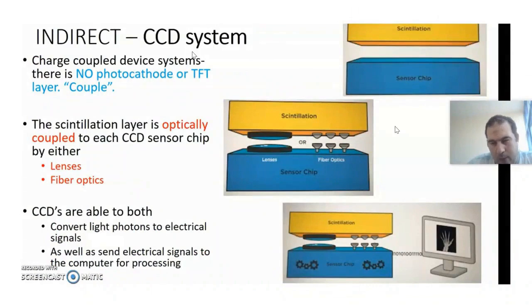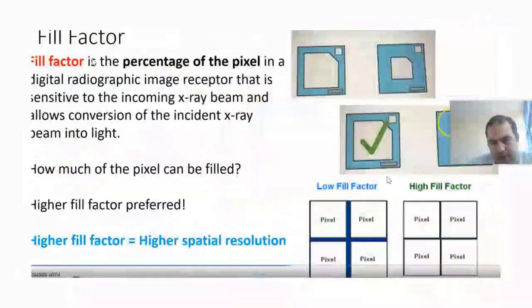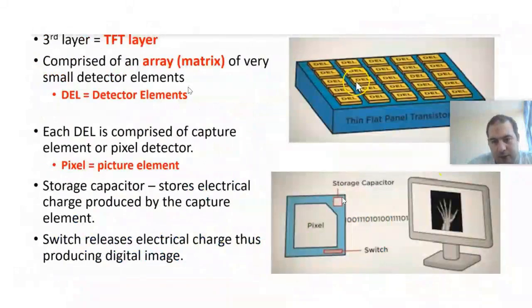What is the function of the storage capacitor? The electric current is coming down on this pixel. What is the purpose of the storage capacitor and how does it work? I also don't understand the point about the TFT. We have concluded that the electrical charge is applied to the TFT. So what happens next?